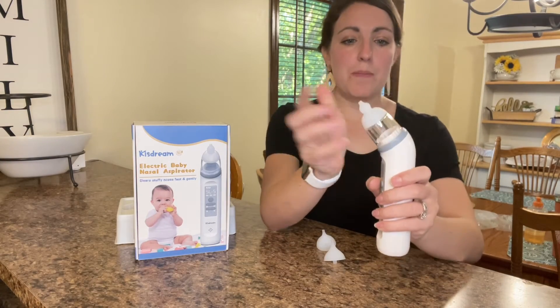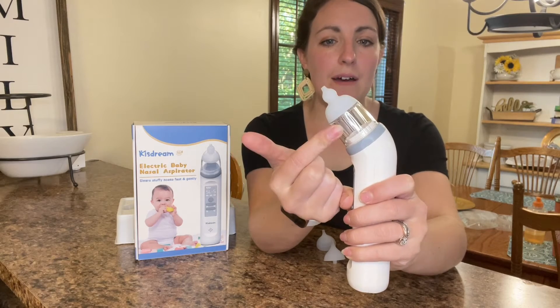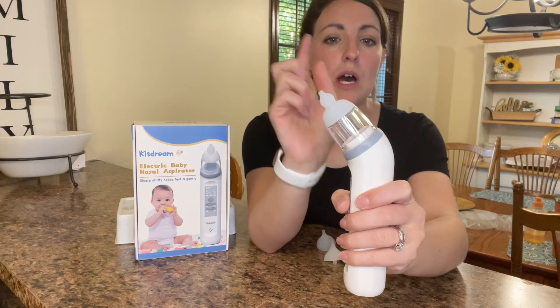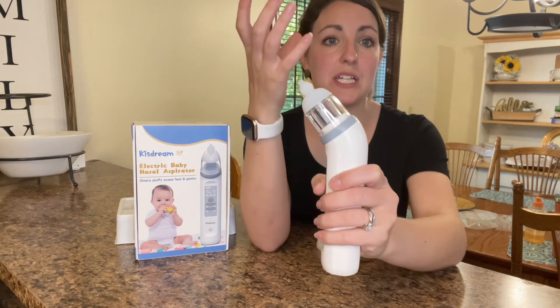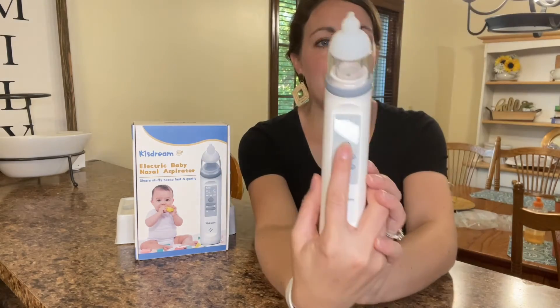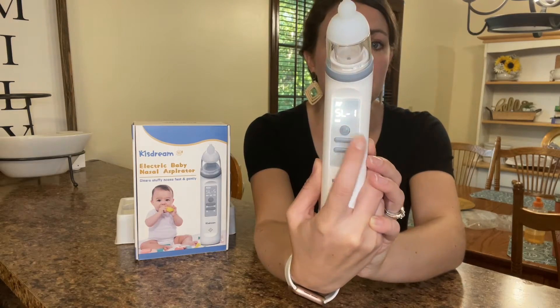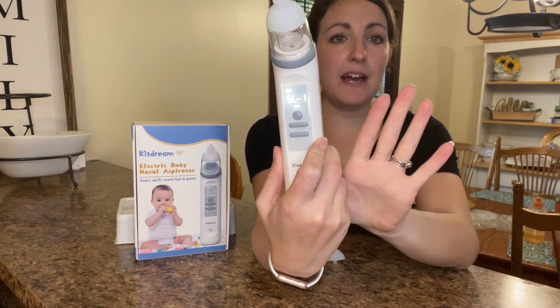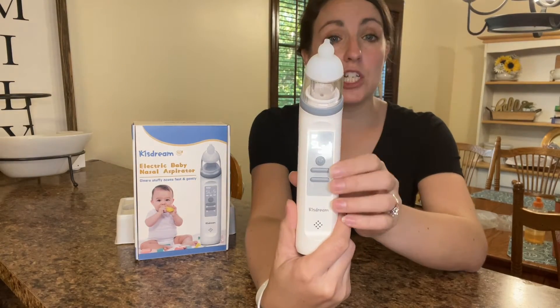Another great feature is how large of a container you have for all of the mucus to come into, and these are all things that can be washed and sanitized after each use with baby. Very simple to use — all you have to do is hold down the power button. It turns on and then there are five levels that you can choose from for how powerful you want the suction to be.